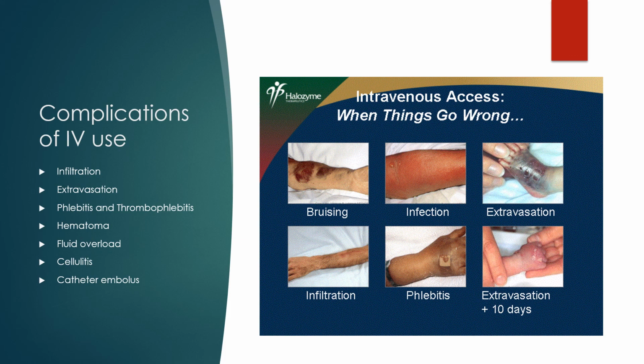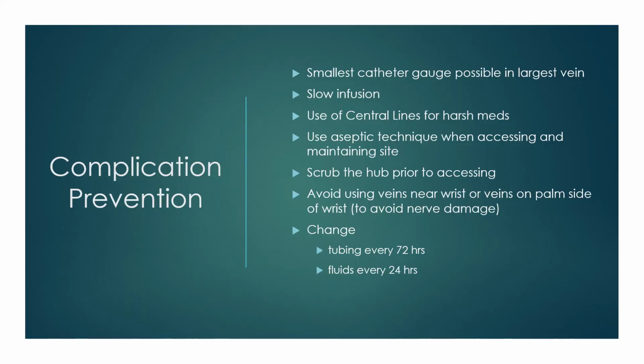Symptoms might be pain at the area. If that plastic piece starts to migrate around the patient, the pain may also move around the patient too. So when we pull the catheter, we're going to notice that tip is missing. If we notice that tip is missing, we need to send them to X-ray, potentially surgery, to remove that floating plastic piece in the body. I have actually never seen that happen, but I'm sure it does happen. So this slide again just goes over each of the prevention measures as nurses that we can take to keep our patients from getting complications because of their IVs.